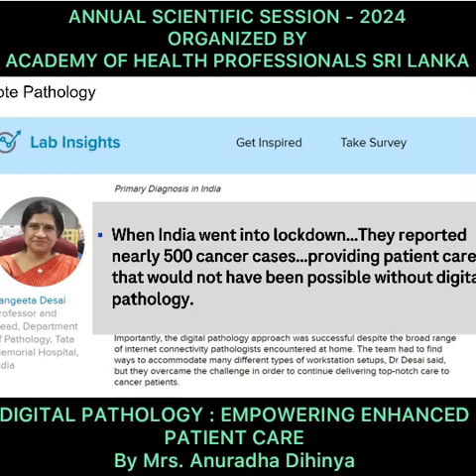So on Friday, in a period of 6 hours, we trained the three most senior pathologists and another three histotechnicians, and we made sure of one more thing: that internet connections need to be stable and the internet speed maintained. While we were training the pathologists and the technicians, our IT people were taking care of the hiccups that came up.